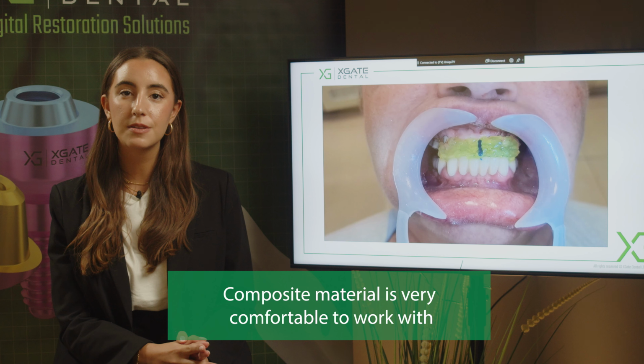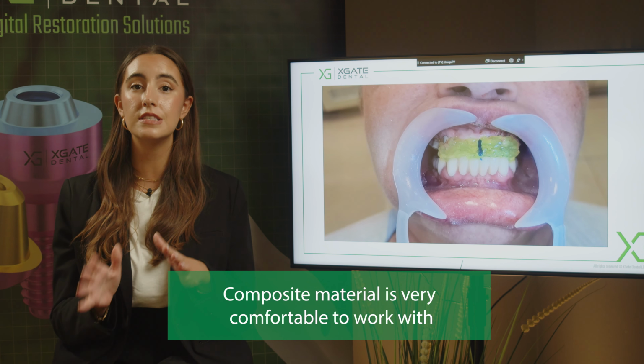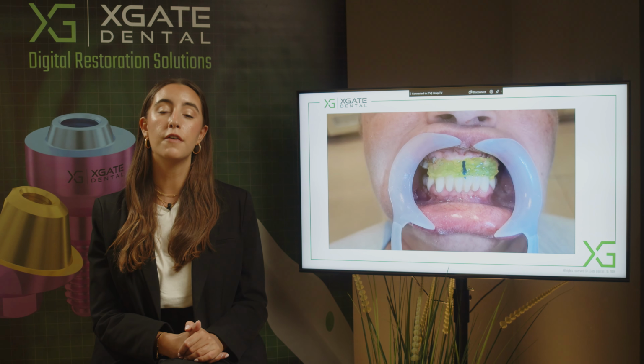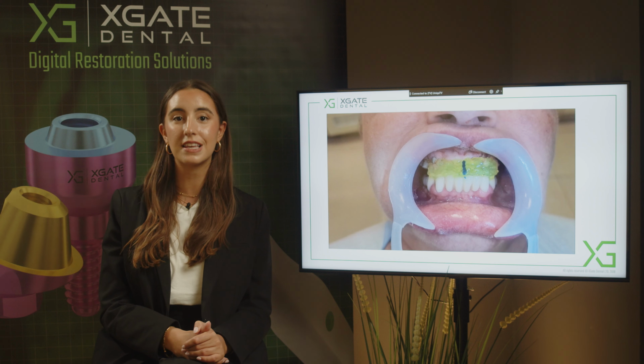And because we built this composite material only in the frontal area, all the palatal area and all the distal scan abutments can still be seen. And then we can place the scan of the composite material with the palatal and the scan abutments on top of the previous scan that we took.